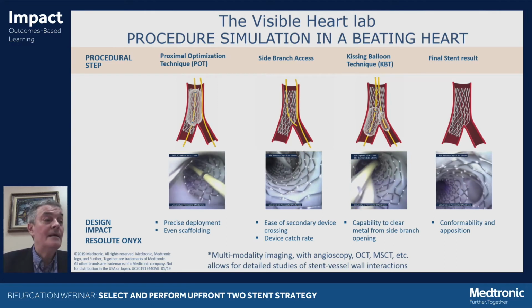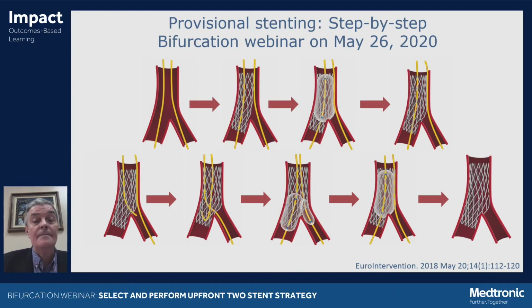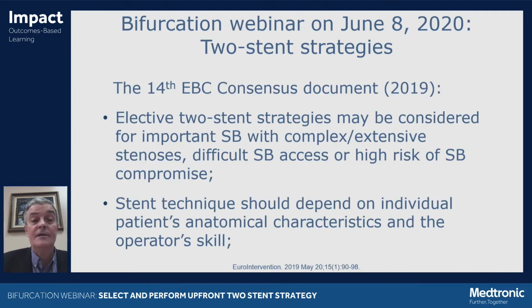It helped us a lot in previous years to improve our technique. And last time we discussed the details of the provisional side branch stenting strategy.